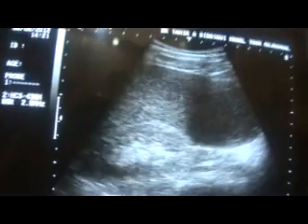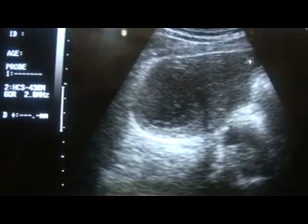It did not change its shape, which goes in favor of a cyst. Secondly, it is filled with mixed echo debris. This is a thick wall. And internally you will see marginal calcification — one, two, three — a few over here. There are very tiny calcifications in the wall.